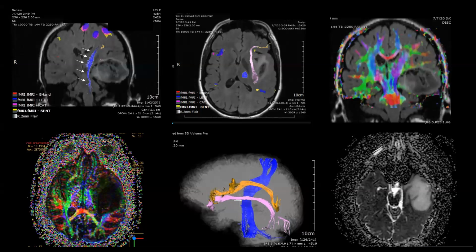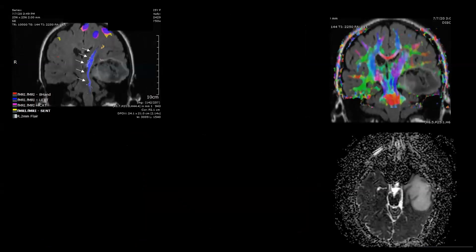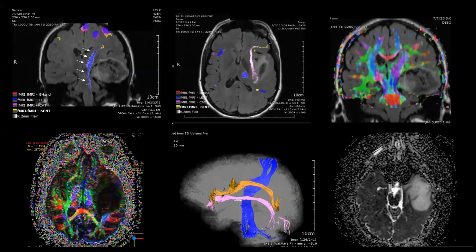Okay. There's only 3 images that have any relevance to my question of what is the diagnosis. These are the 3 images, and these are the parts of the 3 images. This is the only thing in the 6 images that is relevant to the diagnosis that hands it to you, all right? This is a T2 FLAIR mismatch sign. So you can see on the 2 T2 FLAIR images in 2 different planes, a hypo-intense central region with a hyper-intense rim, and you can see on, I believe it was a gradient echo that I showed at the bottom right, you can see homogeneous on T2. Any of the T2 flavors will do. Don't be particular, right? Should we go back just a second? Here we go. Let's go back. Yeah, see it in all its magnificence.